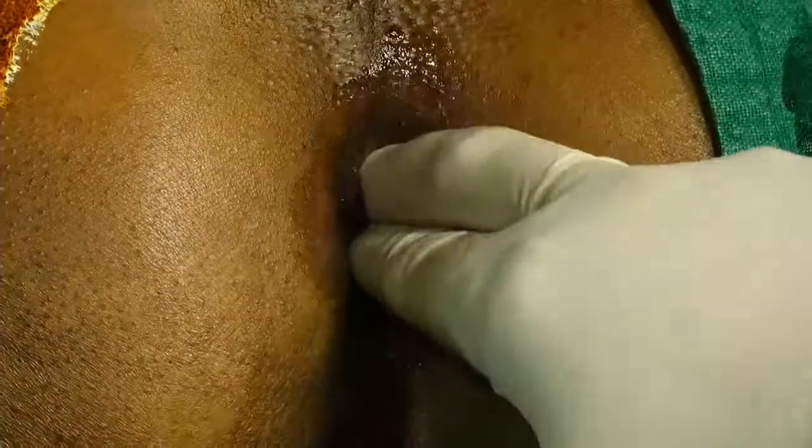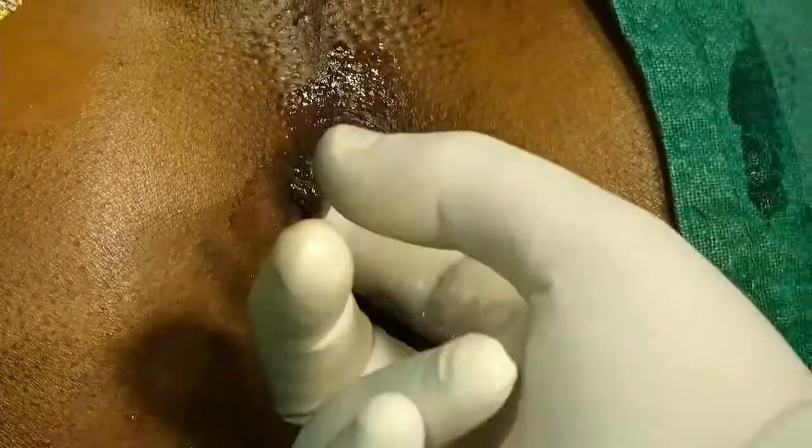Yeah, of course, for grade 4 piles. Yeah, you are right in grade 4. But initially this is grade 3 tag piles, and the rest is grade 1 or 2. I'll show in that proctoscope.